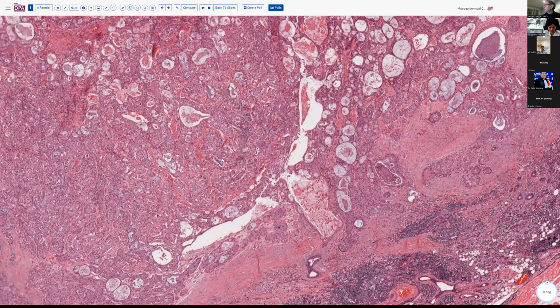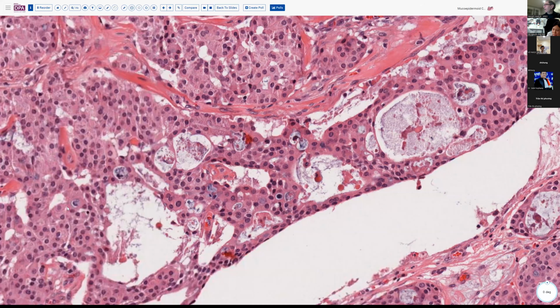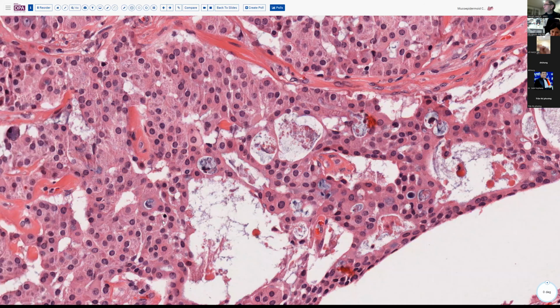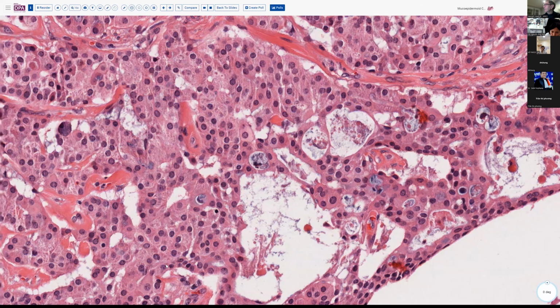We see some sort of cystic spaces here, a luminal type of picture. And this is where you want to be able to identify some intracellular mucin, like some of this material here, as characteristic of the mucoid component of it. Certainly seeing some blue mucin is very helpful. Most of these cells, however, would be the intermediate cells.